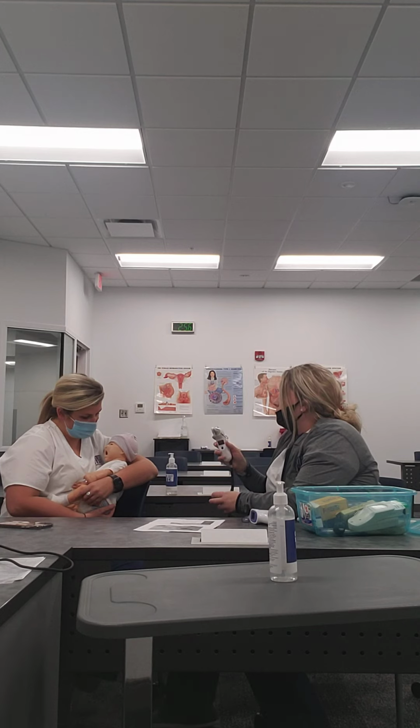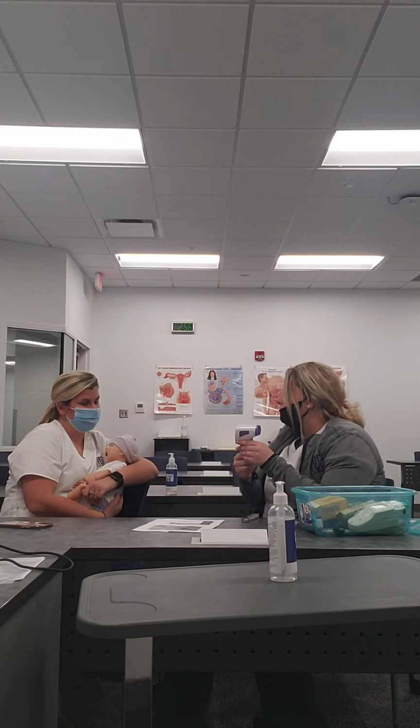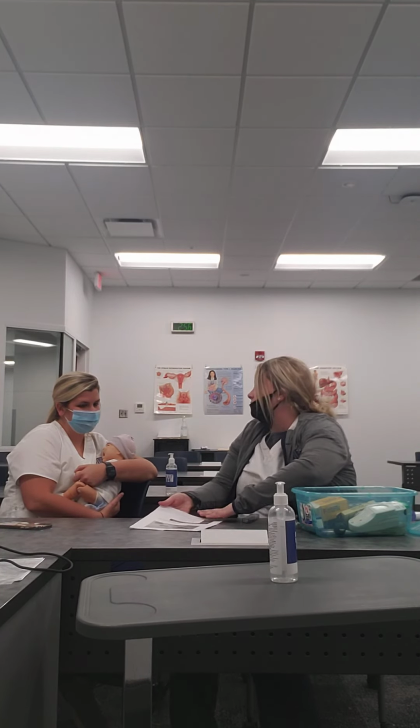And then lastly, or one more, we have the ear. Have you seen one of these before? Okay, so you just turn it on. The normal for that is 96.4 to 100.4. Also, they came out with these new ones. It's COVID. Yeah, it's to scan the head. It's a temporal type. So you've seen these before. Yep. Do you have any questions about this page? I know it's a lot of information.